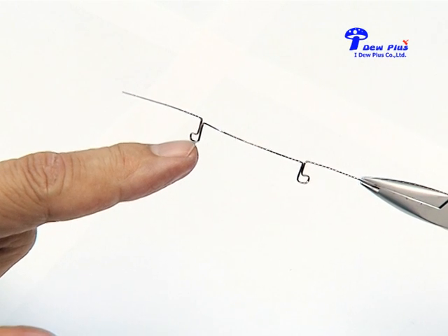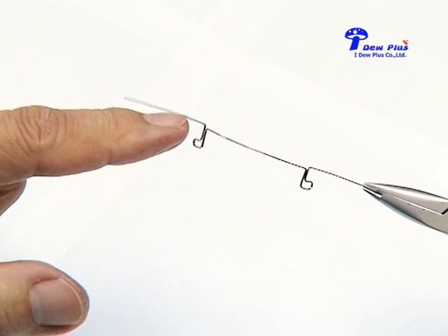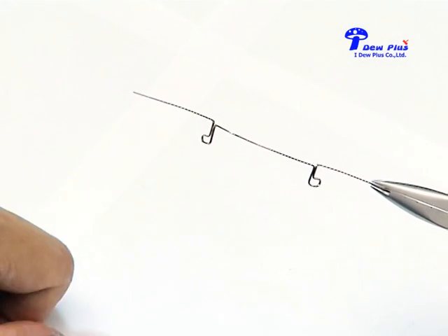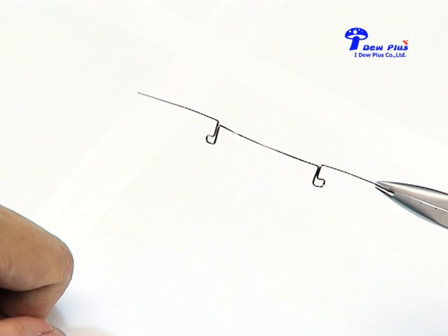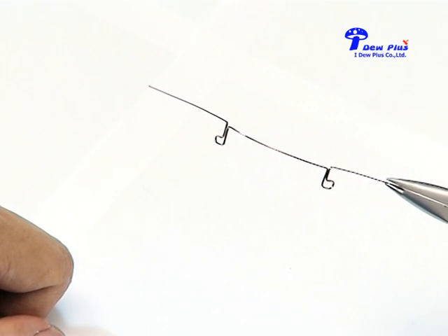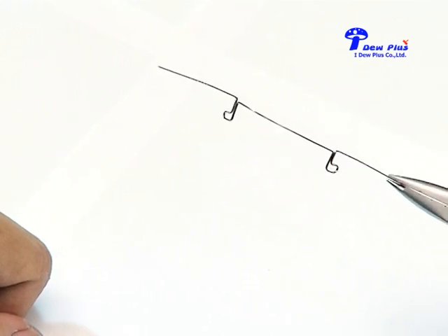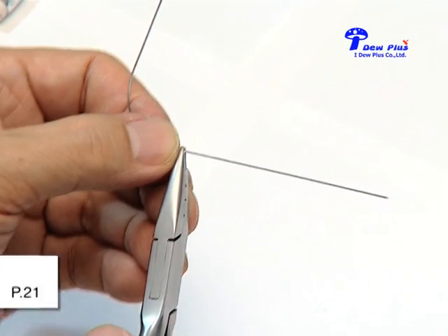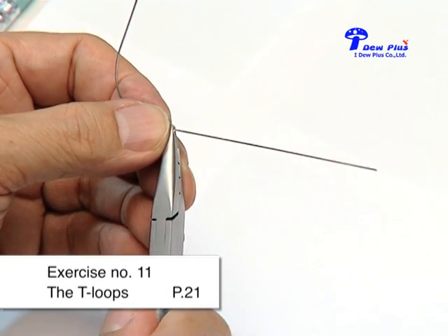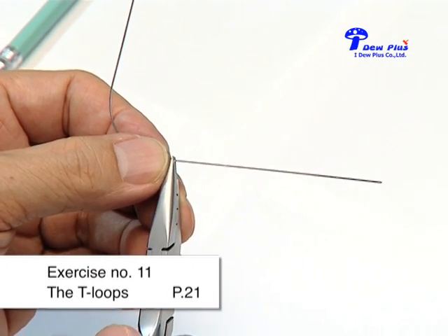This part is designed for extrusion, so the L-Loop is used for leveling purposes. Exercise number 11, the T-Loop. Next is exercise number 11, the T-Loop.